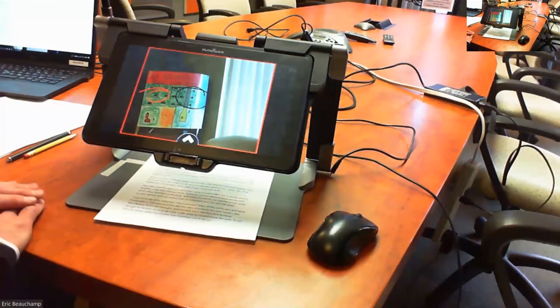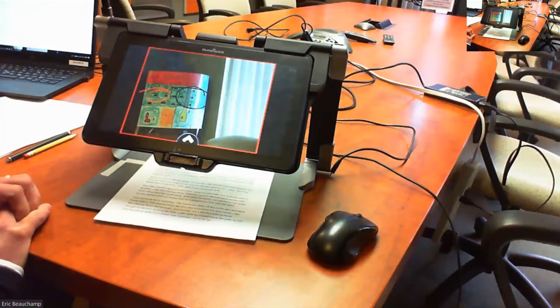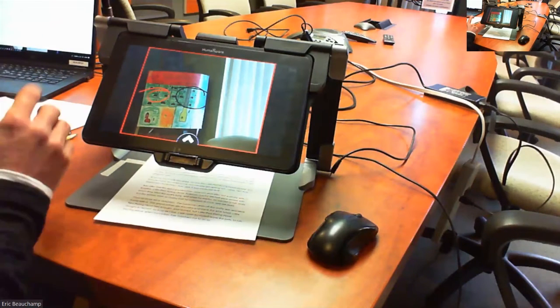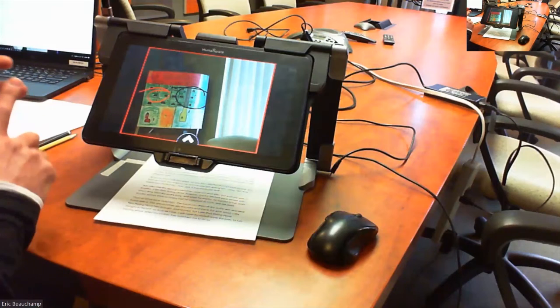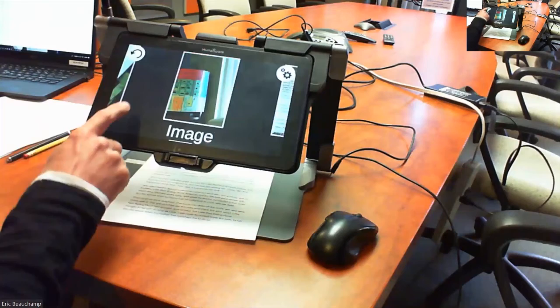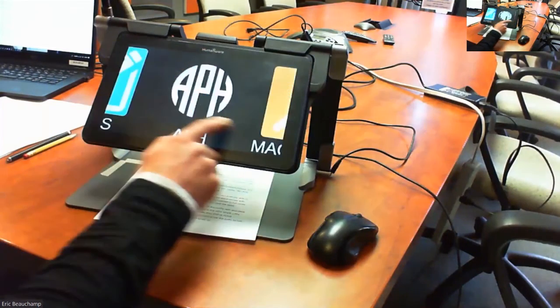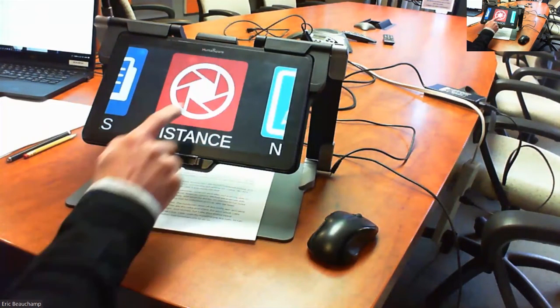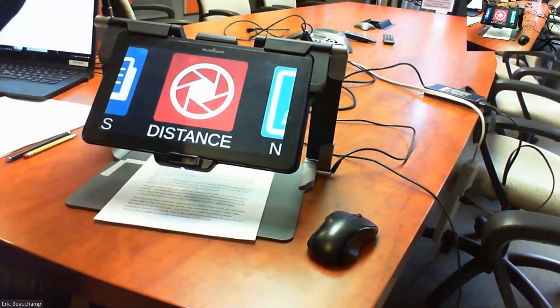We don't support that. The distance application that was designed for the Mat Connect or the Prodigy Connect 12, the firmware has changed. We changed it to accomplish specific things, so to be able to control the capture, to control the zoom in and zoom out, to control also the autofocus on the distance application. So if I go back to my distance application and turn on my, I'm going to show you what I mean, but all these were modified for our use. So the firmware on the camera has been changed.